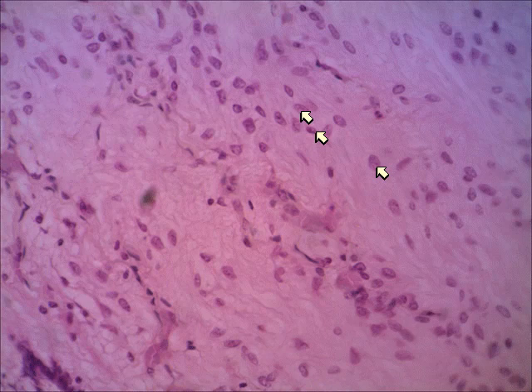But these are types of neuroglial cells that are found in the posterior lobe. You don't have to name pituicyte. Again, you have to just distinguish between the anterior lobe of the pituitary and the posterior lobe. So on your quiz or your test, I may give you a slide that shows, like in the lower magnifications, where you see the anterior and the posterior lobe in the same field of view, and you have to know which is which. And you need to know that's the pituitary gland.